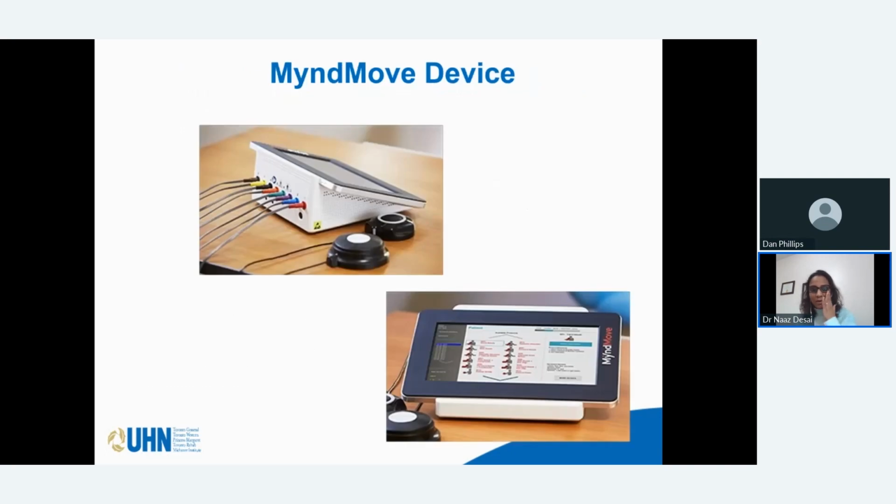So this is what the stimulator looks like. This one has inbuilt programs, so you can select what you want to train based on the individual presentation of the patient: proximal function, distal function, or a combination of proximal and distal function. Then the stimulator will take you through the steps of setup. Once you have set up the patient, you can operate the stimulator using these round push buttons. These push buttons can be operated with the hand or leg, so mostly we put them under our feet because then we have the hands free to guide the movement.